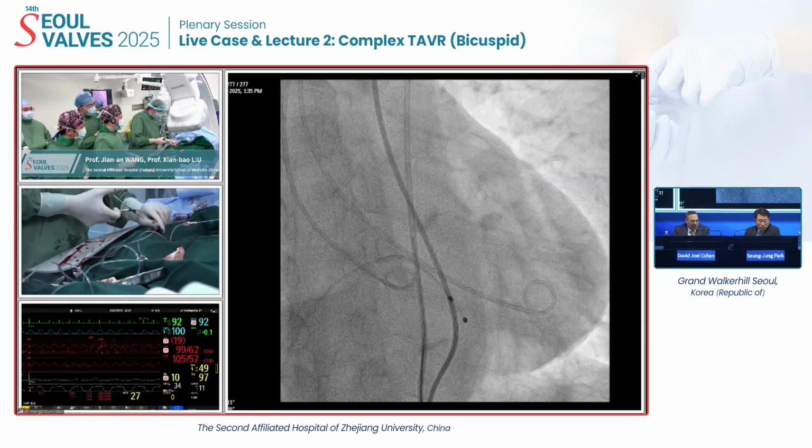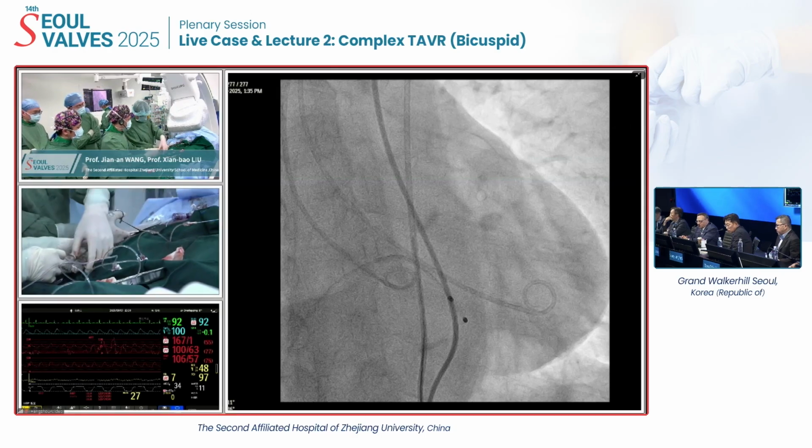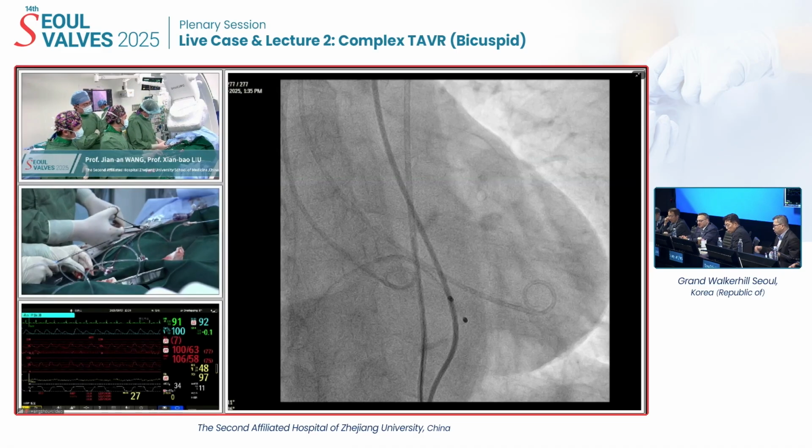Yeah, so I think the idea of inflating with a balloon is a nice one, but we're not. Well, you got somebody strong to put those together, huh?